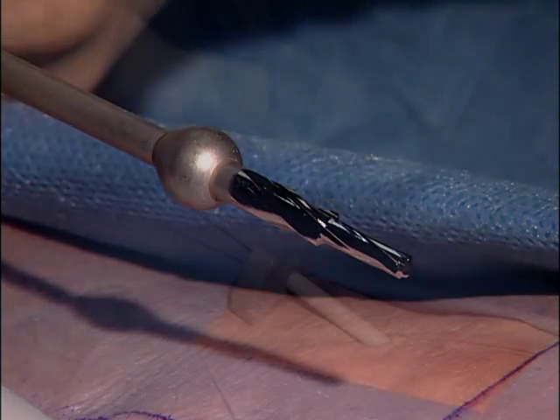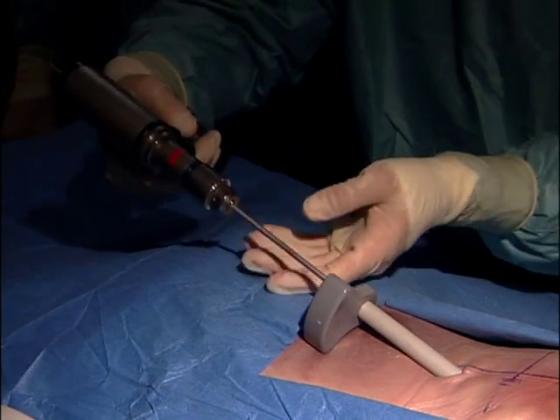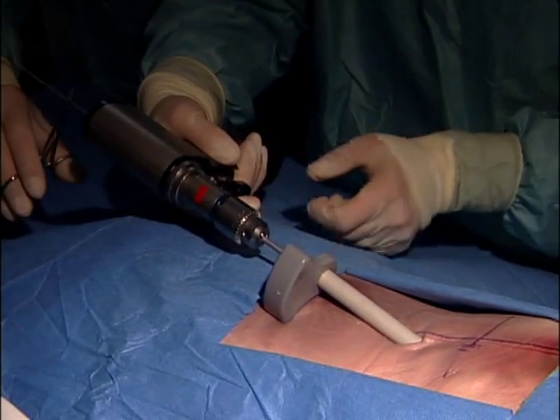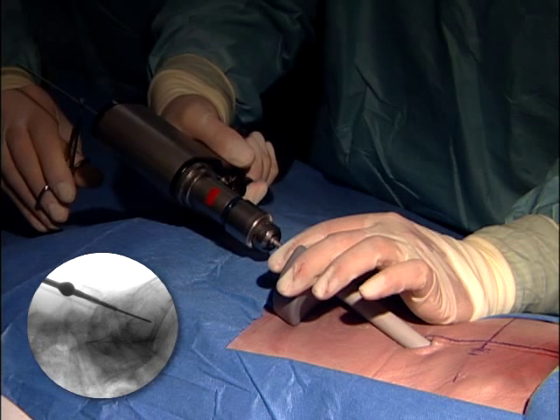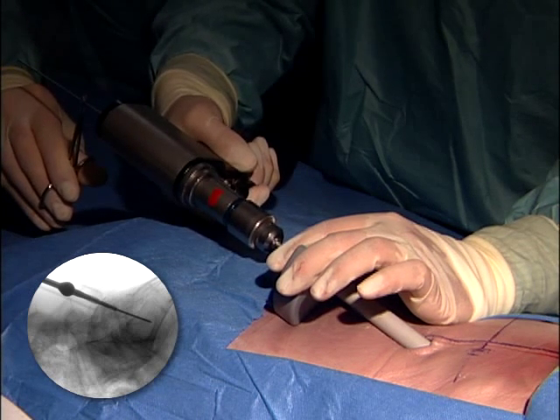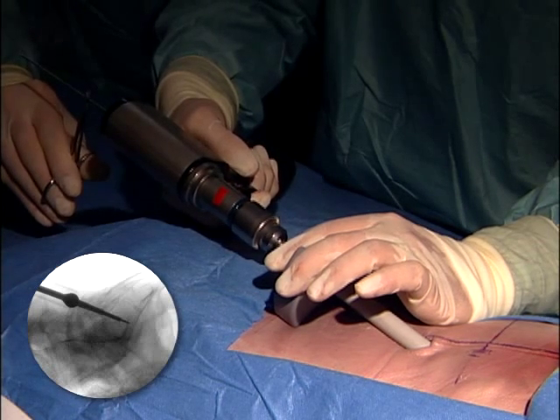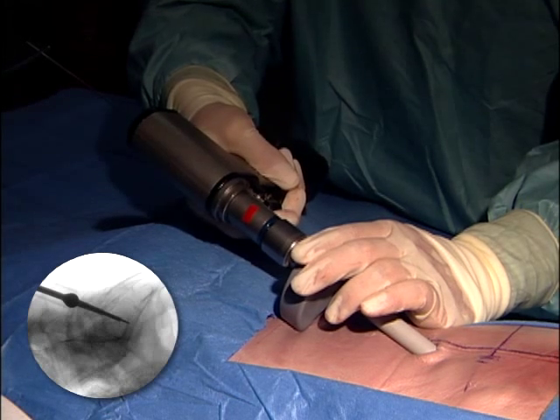The cannulated 2-in-1 drill is connected to a cannulated power drill with an AO-style quick connect or Jacobs chuck adapter and passed over the K-wire down to the facet. During drilling, intermediate fluoroscopy images are taken to ensure that the K-wire is not advancing. The drill is advanced under power until the depth-limiting feature contacts the bone. This is confirmed through fluoroscopy.